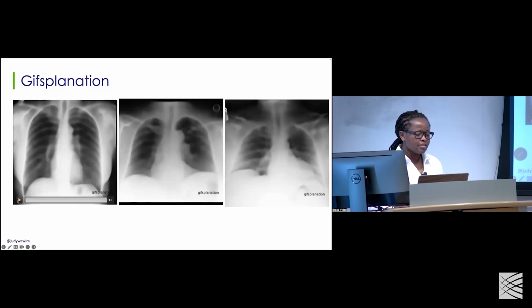And so this was just showing that maybe it's the shoulders that are moving a lot across different groups, but they still were not very helpful for us to figure things out. It was good to try something new, but this area of just looking at the images and understanding where the model has gone through was limited. We've subsequently done some adversarial biasing work where you try to penalize the model for learning a protected attribute.